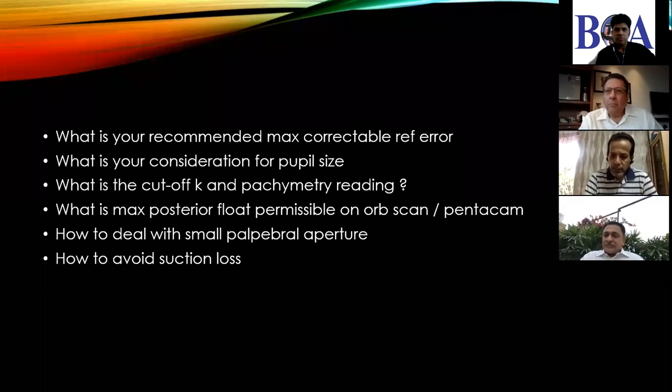Okay, fine. I think I would just generalize one thing. The most safe in 90% of cases, I would say, is a 6.5 kind of optic zone overall, which helps you to reduce most of your problems. The more you economize after that and go to 6, 5.5, all problems start there.